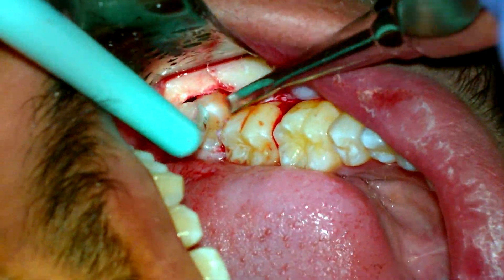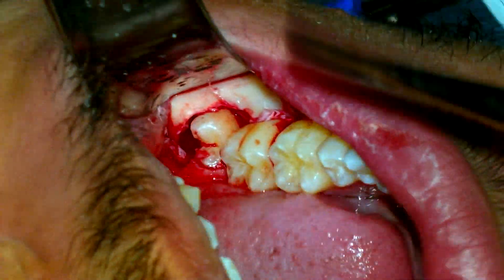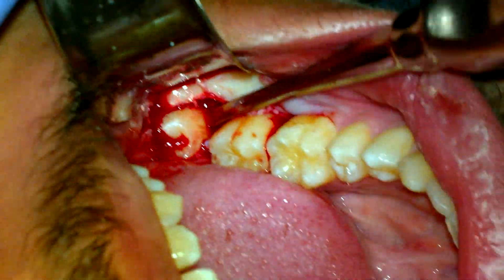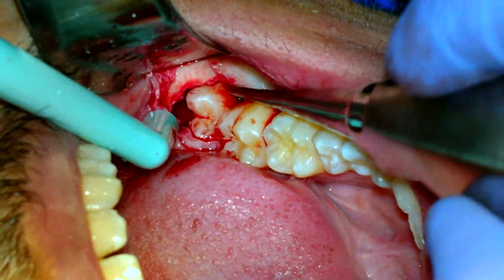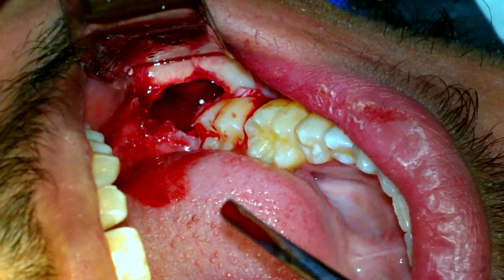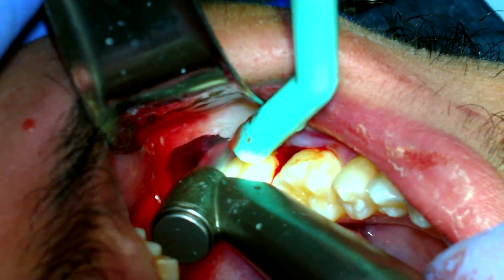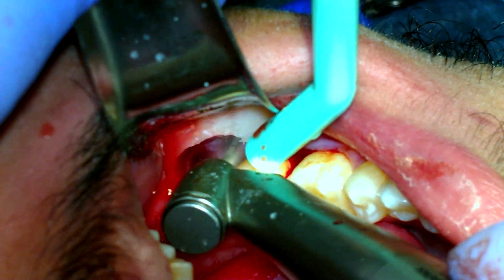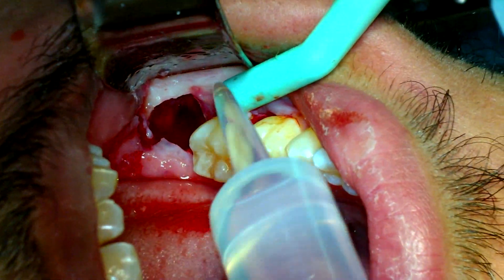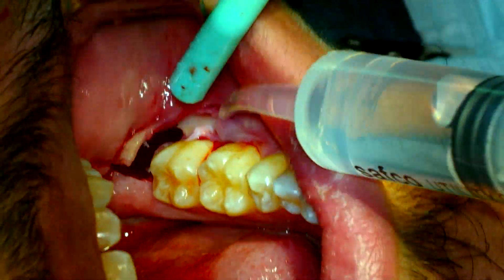And the mesial part — are you in pain? You're okay? Suction. Tube suctioning. Suction here — you will heal very nicely. Suction. Irrigation.